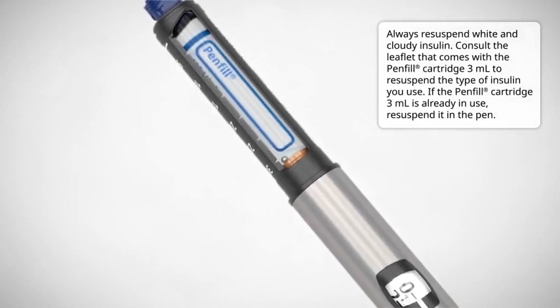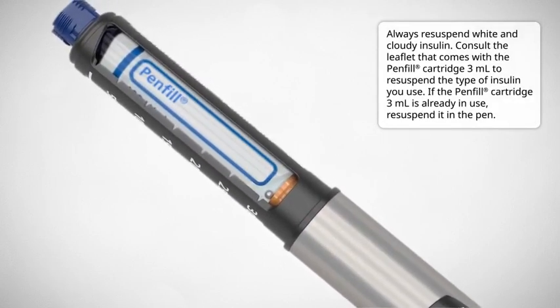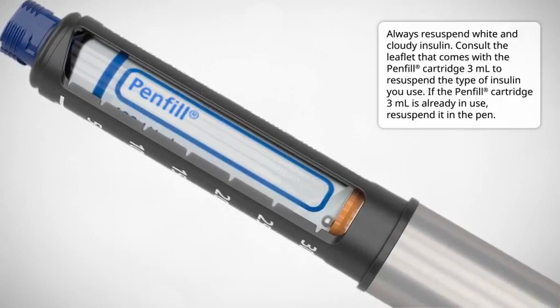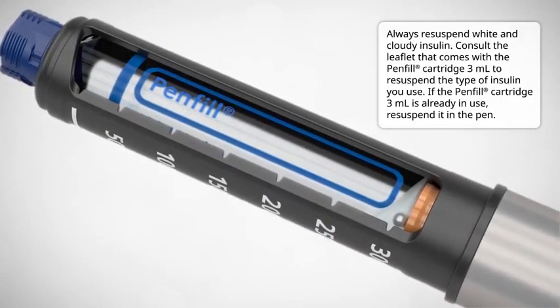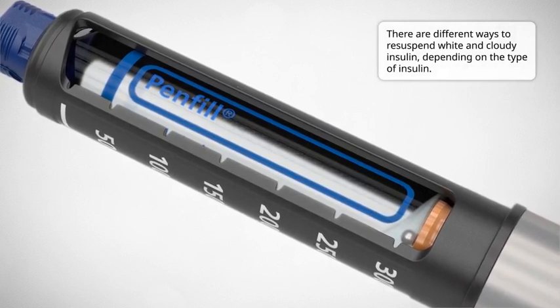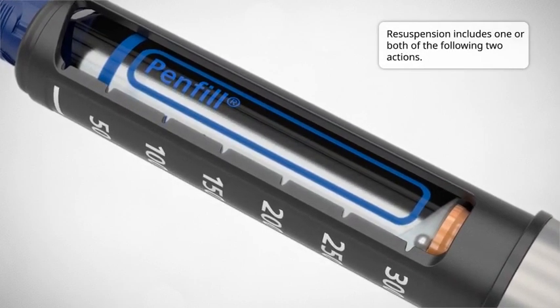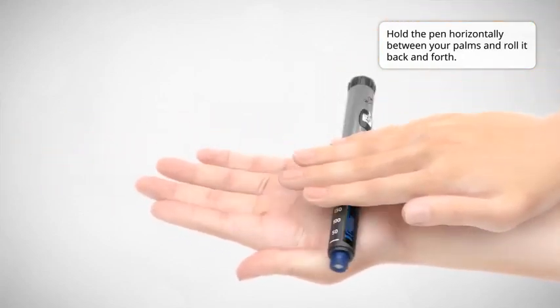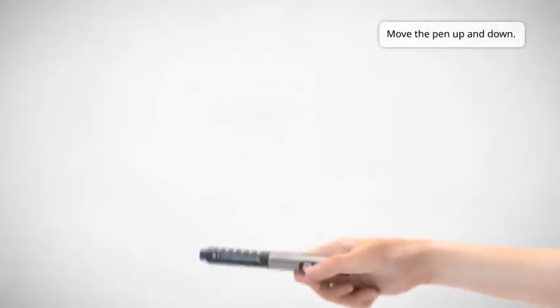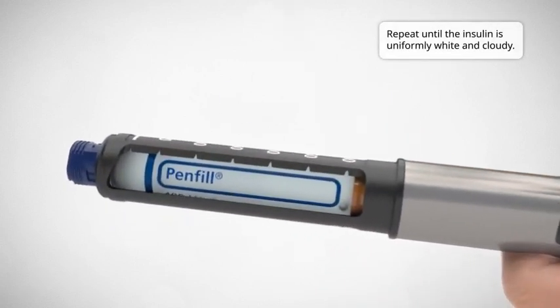If you use cloudy-looking insulin, also called white insulin suspension, always resuspend it before injection. The leaflet that comes with a Pen Fill cartridge 3 ml will show how to resuspend the type of insulin you use. If the Pen Fill cartridge 3 ml is already in use, resuspend it in the pen. There are different ways to resuspend white and cloudy insulin, depending on the type of insulin. Resuspension includes one or both of the following two actions. Hold the pen horizontally between your palms and roll it back and forth. Move the pen up and down. Repeat until the insulin is uniformly white and cloudy.